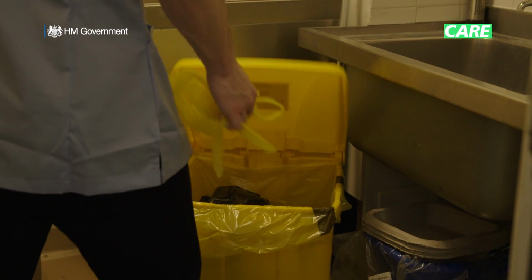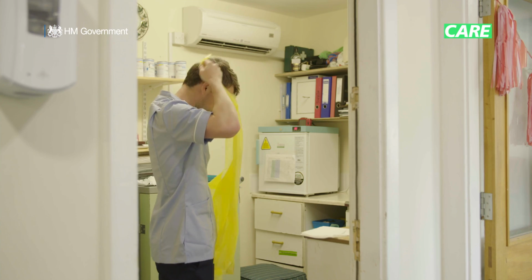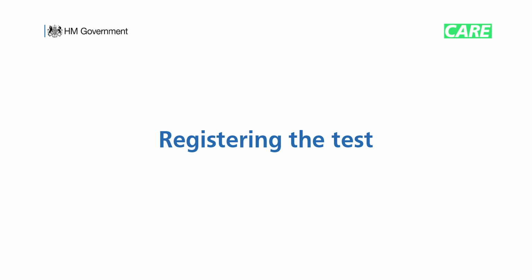You can remove and safely dispose of your personal protective equipment. Remember, even if you're doing another test, you need to wear a new set of personal protective equipment. When the courier arrives, give them the fully sealed collection envelope, remembering to stay at least 2 meters apart. Don't forget to register the test online as directed in the instructions. If you don't do this, you won't receive the result.